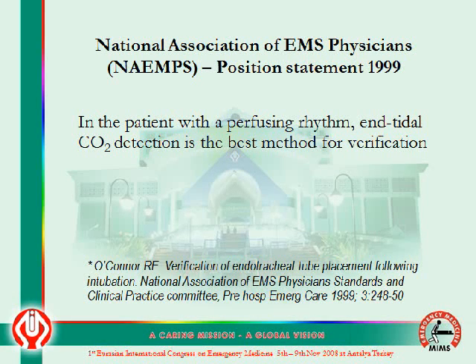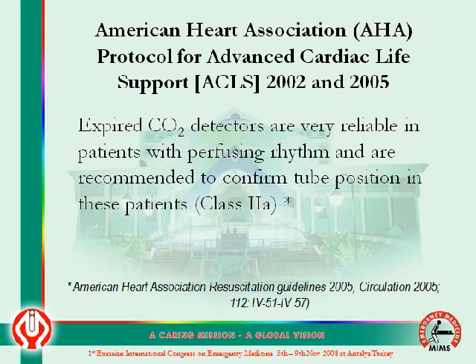The National Association of EMS Physicians placed their position statement in 1999. In their statement, in patients with a perfusing rhythm, end-tidal carbon dioxide detection is the best method for verification. The American Heart Association, in its protocol for advanced cardiac life support and resuscitation guidelines placed in 2002 and 2005, states that expired carbon dioxide detectors are very reliable in patients with a perfusing rhythm and are recommended to confirm the tube position in these patients.